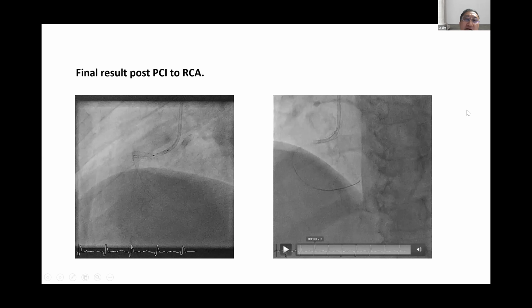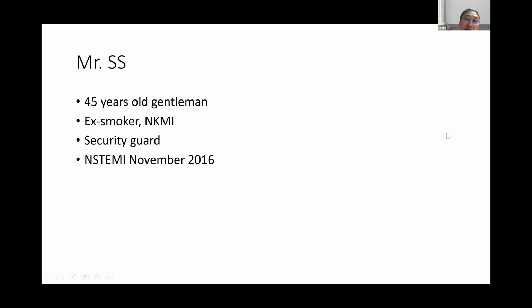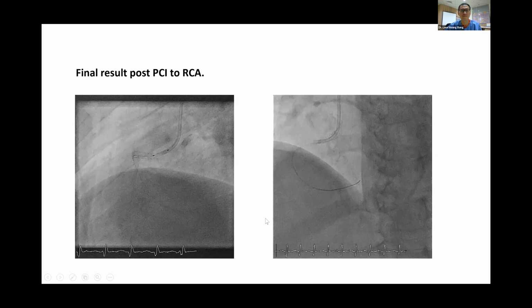Yeah, a technique that is also used in renal artery stenting and for left main ostial RCA. I think this is a very important technique, and also a similar principle to having a balloon while advancing, leading the advancing edge of the guide extension catheter. Yeah, you reduce the trauma, you reduce the space, and you also make it less likely to injure the surrounding structure. Very important point.